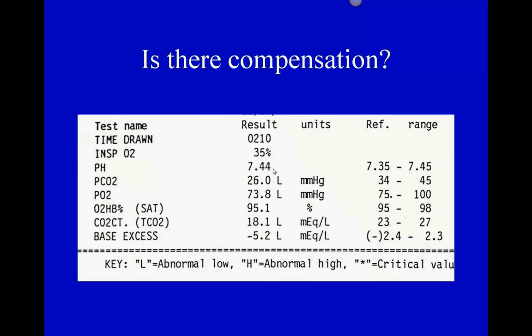By telling you respiratory alkalosis, I'm telling you the CO2 is lower than it should be, and that caused an alkalotic pH. Now I look to see, has the other parameter, in this case the metabolic system, the kidneys, are they trying to fix the problem? Yes. So I say, have they moved outside their normal range? Yes. Have they brought the pH back within the range of 7.35 to 7.45? Yes, I have completely compensated.